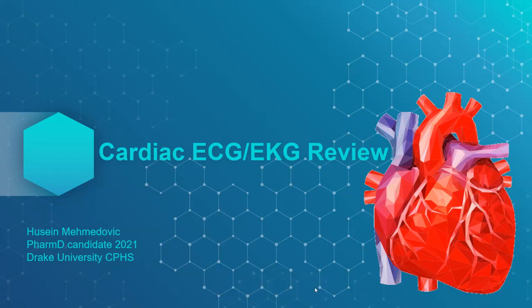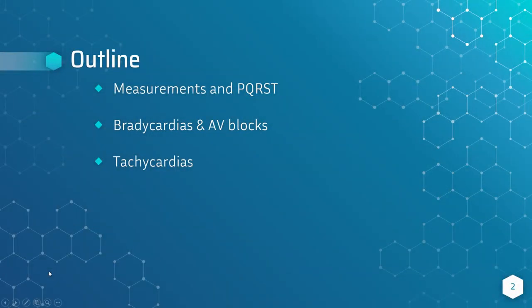I'm currently a P4 rotation student at Drake University, a PharmD candidate of 2021, and this presentation is over cardiac rhythms and review. So the basic outline for this is going over measurements, the PQRST, going over rhythms for bradycardias, heart blocks, and then tachycardias.